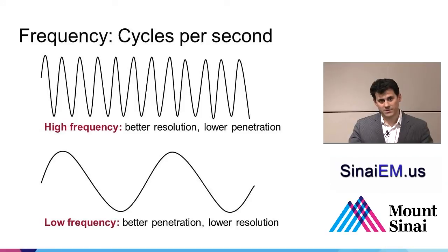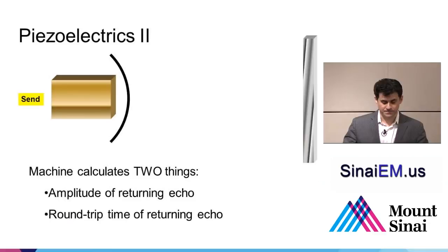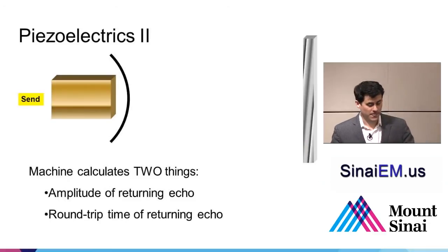And again, the deeper, lower resolution is good for imaging things like the abdomen, where there's a lot more tissue to go through. It doesn't give quite as much detail as you have with those nerve endings and the superficial tissues of the skin, but it penetrates a lot deeper and it can give us information at lower resolution and at lower frequency.